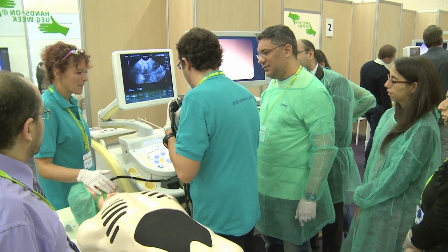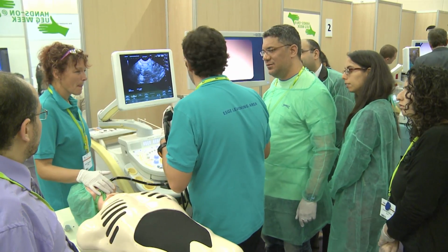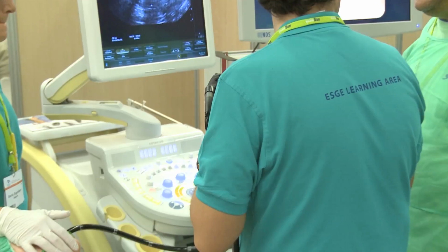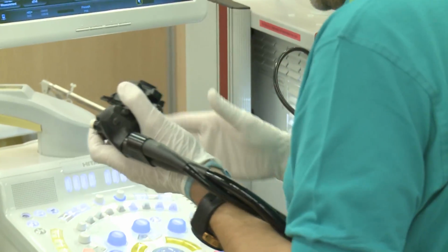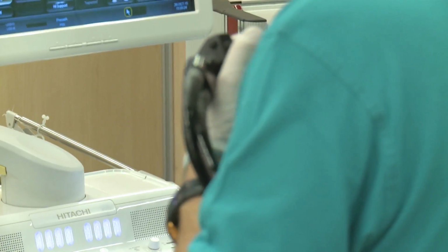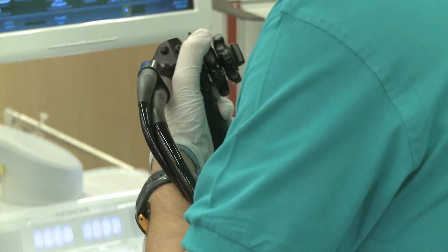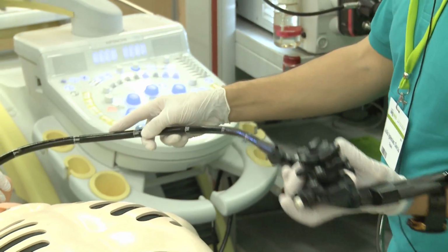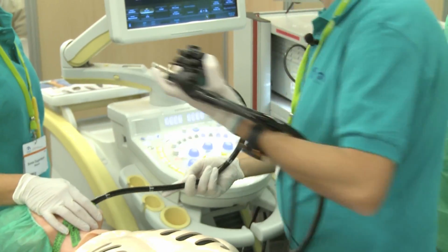This is for all endoscopists of upper GI and very advanced, because for endoscopy you need to have the scope very straight. And I learned this from Jack, that for some specific moments you need to have the scope straight. But for EUS it's just another option. It's just to be more comfortable.